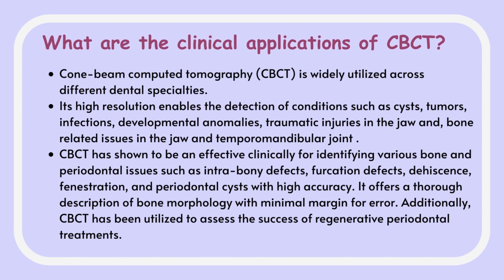What are the clinical applications of CBCT? Cone beam computed tomography is widely utilized across different dental specialties. Its high resolution enables the detection of conditions such as cysts, tumors, infections, developmental anomalies, traumatic injuries in the jaw, and bone-related issues in the jaw and temporomandibular joint.